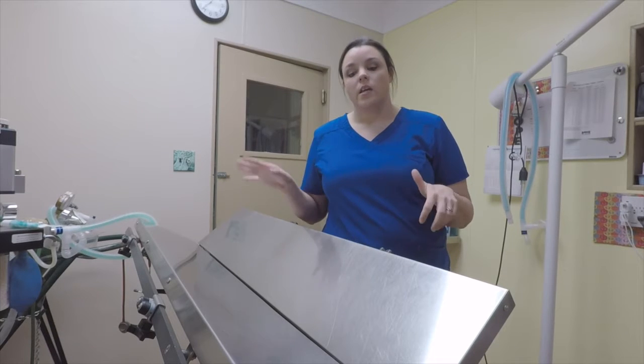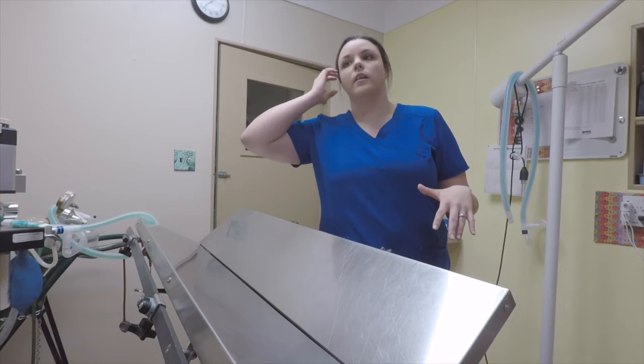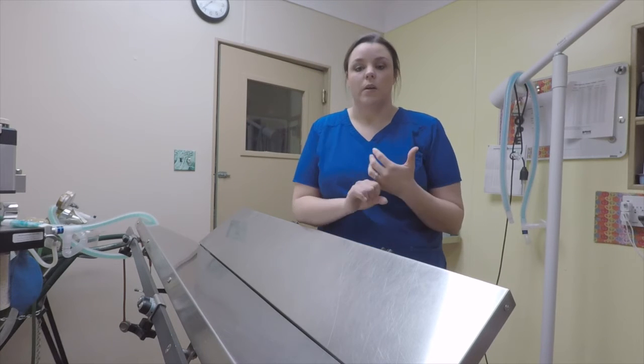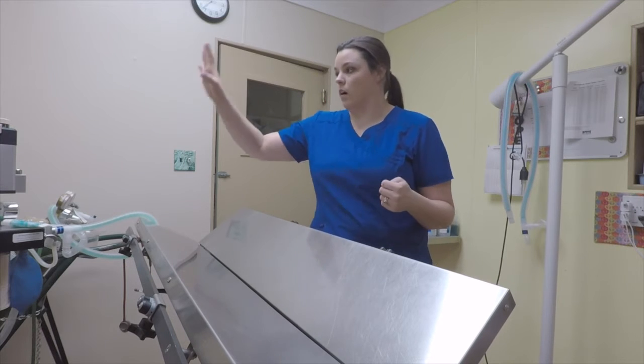The surgeon is finished with the surgical suite. You need to clean it. You need to clean everything that was used. Even if it wasn't used, go ahead and clean it. Make sure to carry out the trash after every surgery and wipe down all of the equipment.